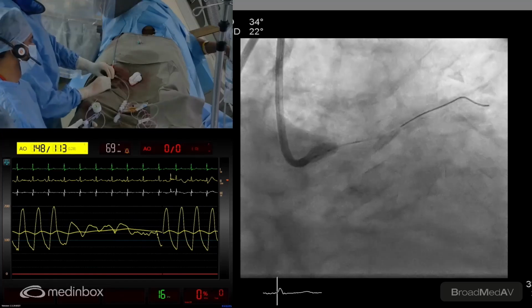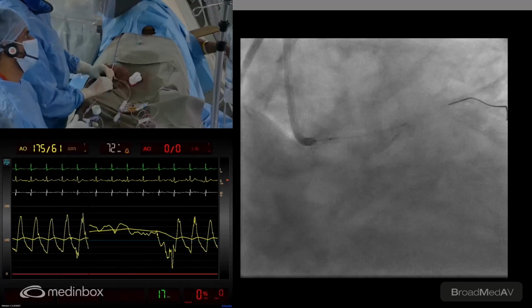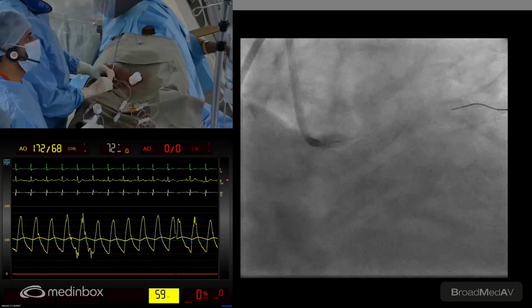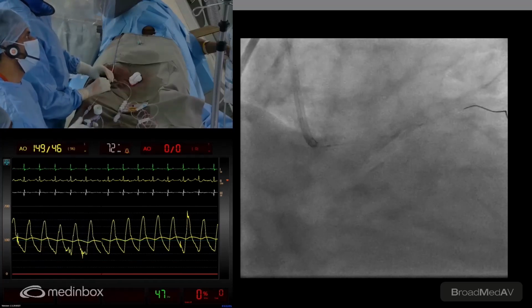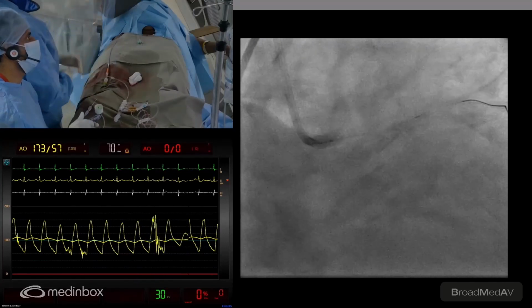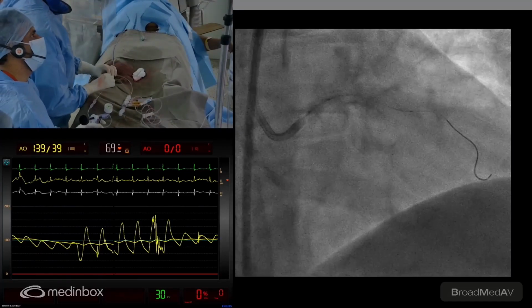Just go 6, to nominal, 7, please. 8, 9, 10, 10, 12. So that's a 5. Deflate. Go up here, please. 5, 12. Deflate. Inflate. PA cranial now on the 12. Move quickly. So you can see it's well applied. Deflate, please. Yeah.